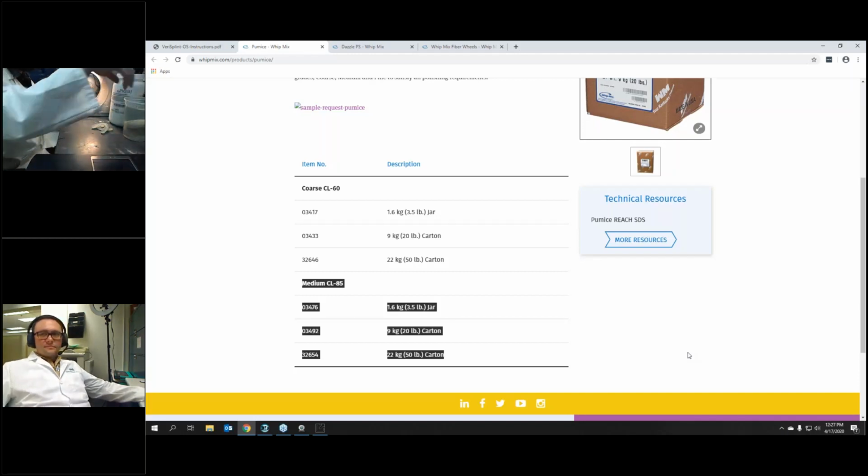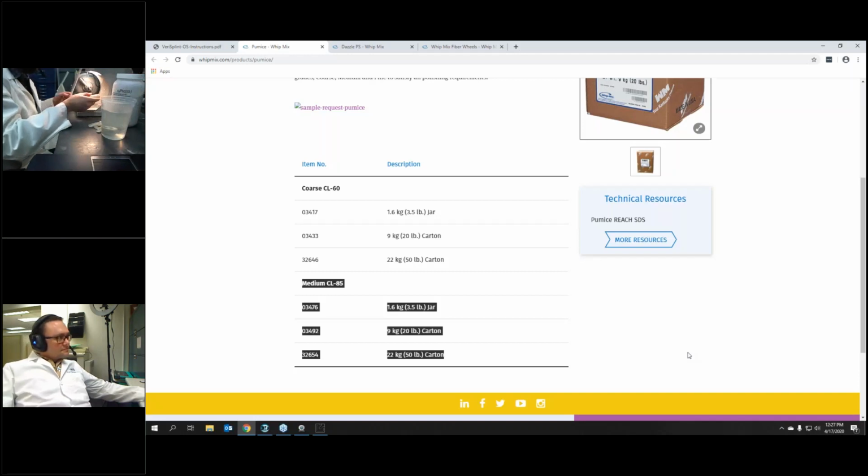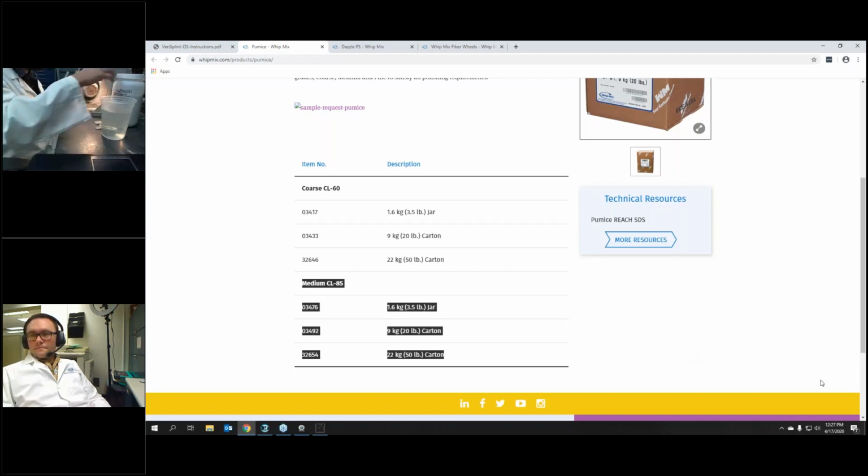So I have two different types of rag wheels that I'm using for the pumice. I have a smaller one and a larger one. I'm going to start with the larger one. All right, let me go and throw a little bit of water in.